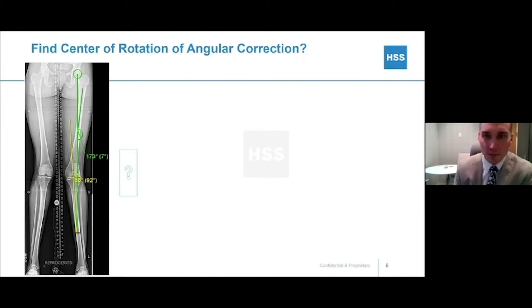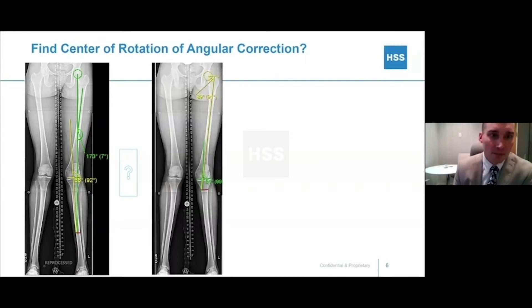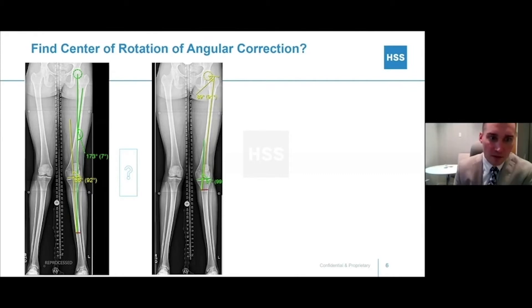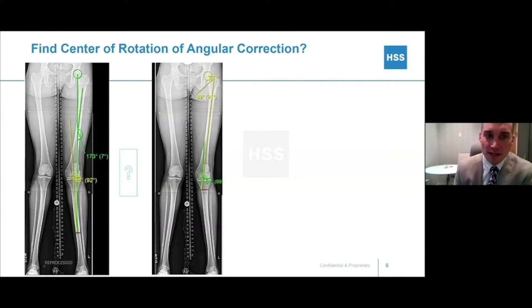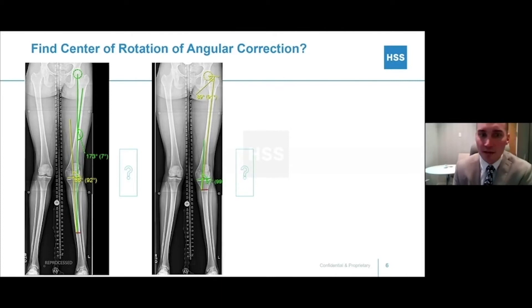You're wondering what you did wrong. If you try to do this with anatomic axis planning instead, you can see proximally a pretty normal line down the femur, exiting medially with a normal anatomic line. But those are also intersecting in the proximal tibia, so something is still amiss. It can be really hard to use this technique to find where the deformity is coming from, even though you've already identified that you think it's in the femur.